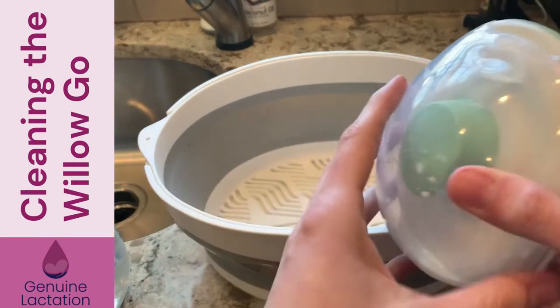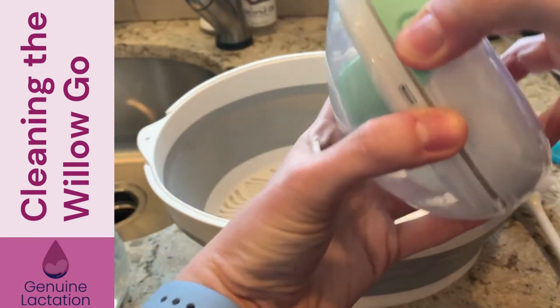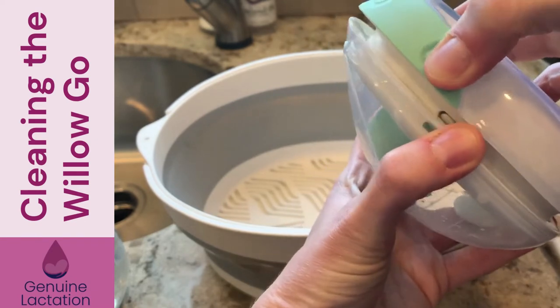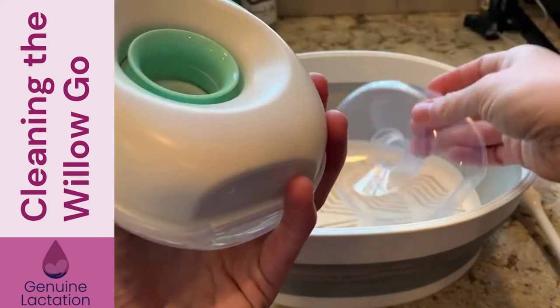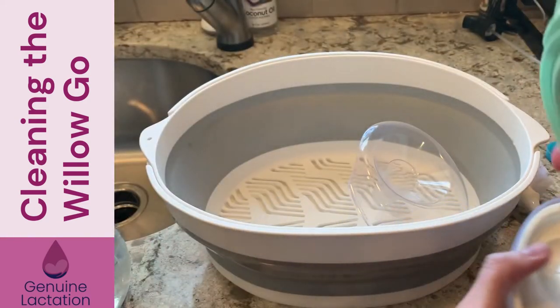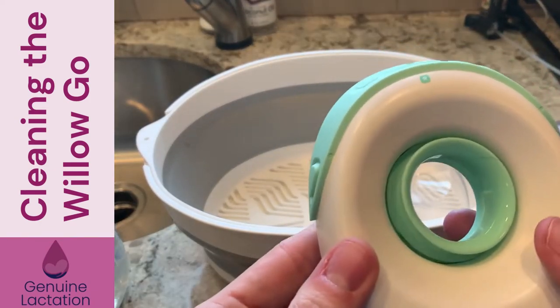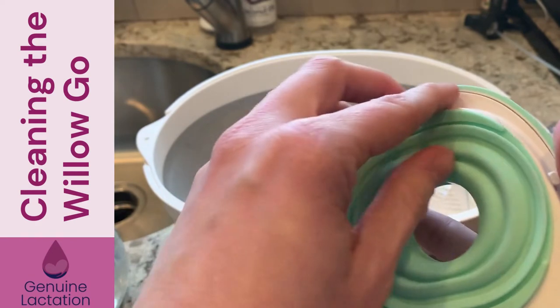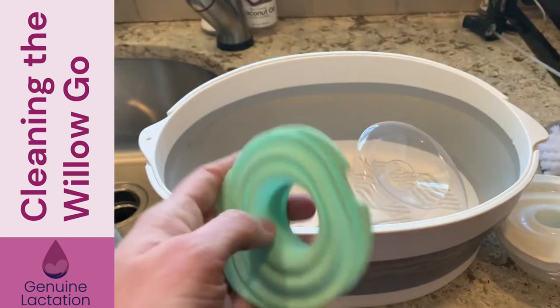We're going to take the Willow Go. We've emptied out the milk container, and you're going to use the two side clips to release your milk container. The flange popped off first. You're going to take your insert out and put your flange in. You want to be very careful with this piece right here, which is your hub. When you're taking it apart, if you're being absent-minded and not paying attention, you could accidentally wash your hub, which would be bad. So put your hub to the side.